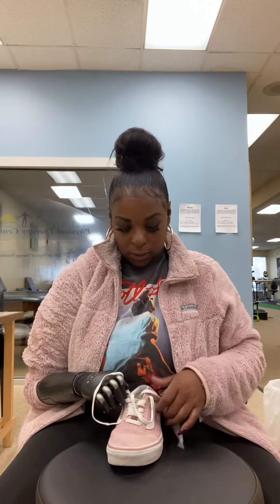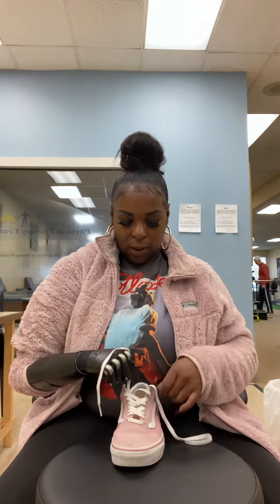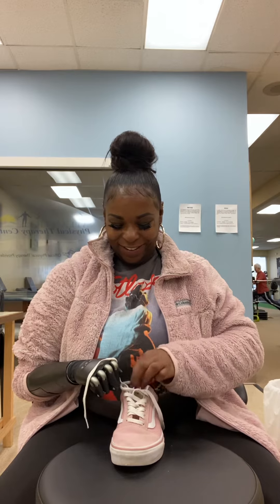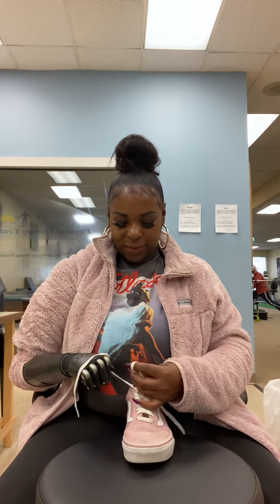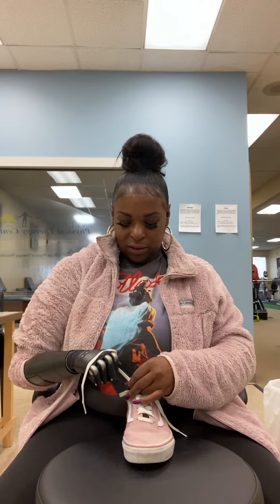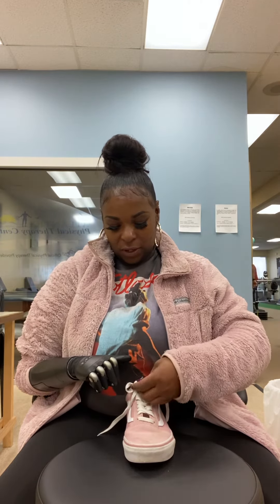Now I got the lace, and now I'll do a pull. All right, now this will get tricky — the bunny ears. Everything I learned does not work now, so it's just gonna get a little tricky.